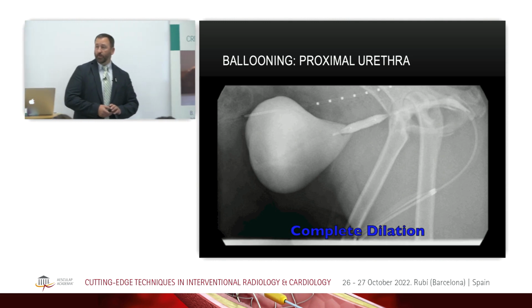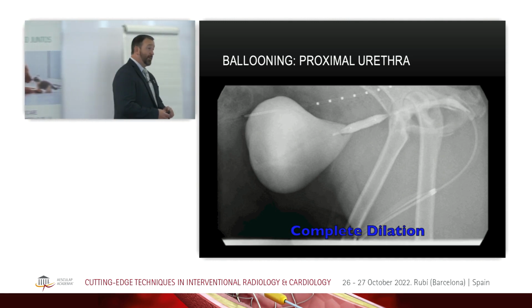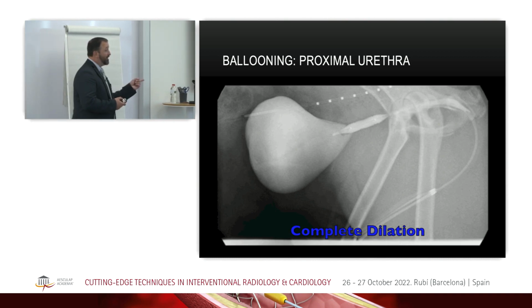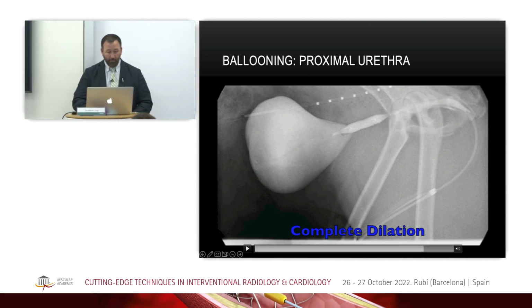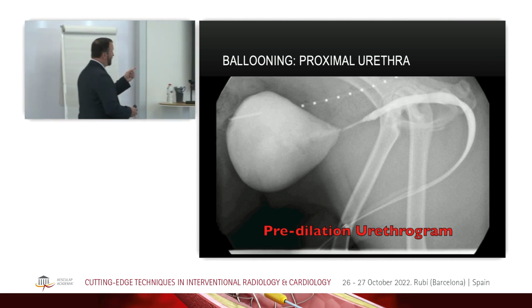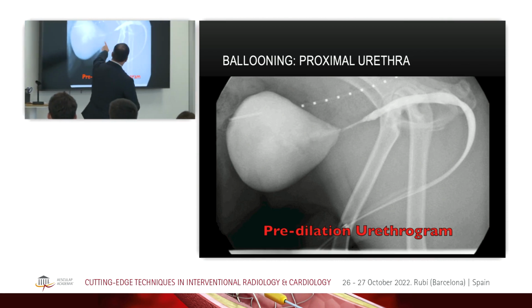Was there another question? You just said it, but in terms of diameter, go for the waist that disappears and that's it. Exactly. The question is about figuring out the diameter and the waist. We use the normal urethra as a guideline. If you come back here, I forgot to mention that, before we place the balloon, you can see the marker catheter in the rectum and the colon.